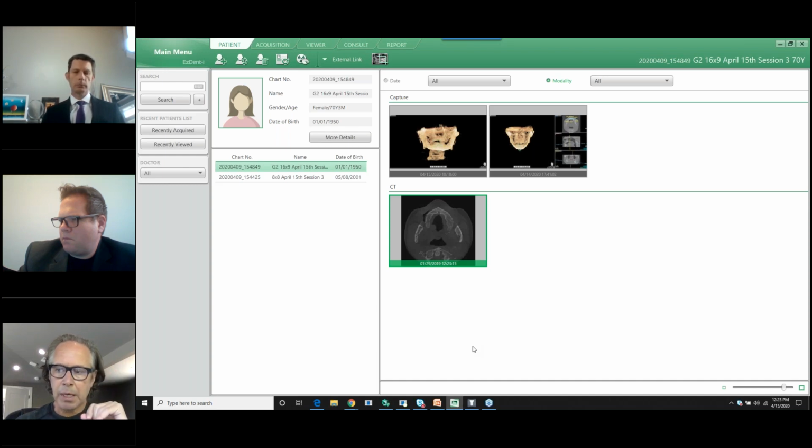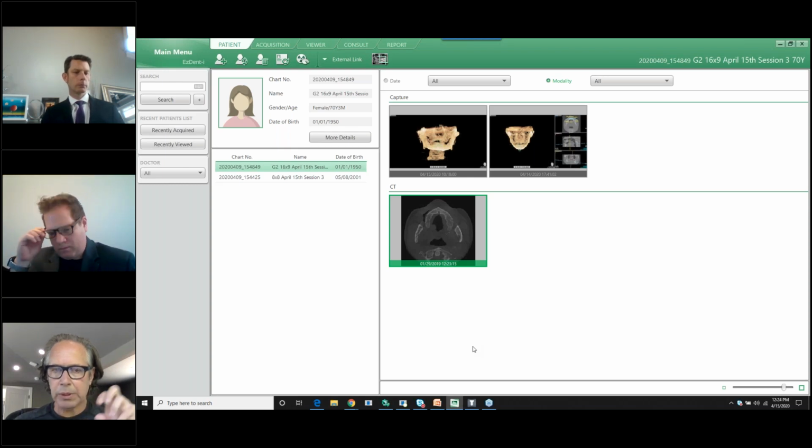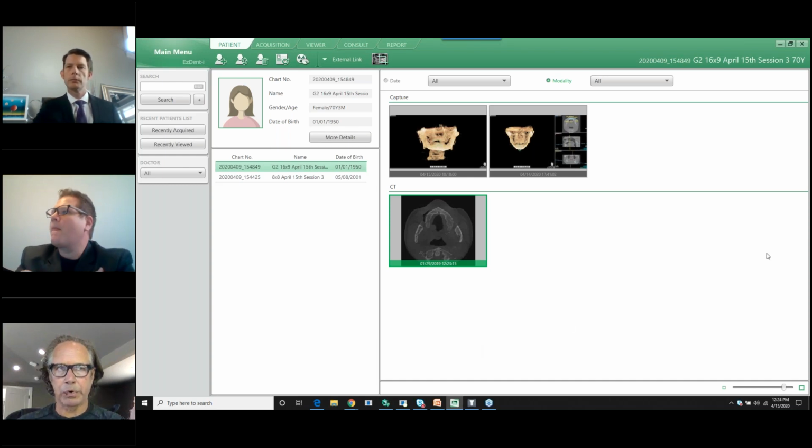It was a moment that I wasn't very happy with, to be honest. And again, I put the whole thing in there in the webinar, and I showed what happened step by step, including the result. When you are going to a lab or you're going to a guide maker, the number one thing that should be on your mind is not the price of the guide.